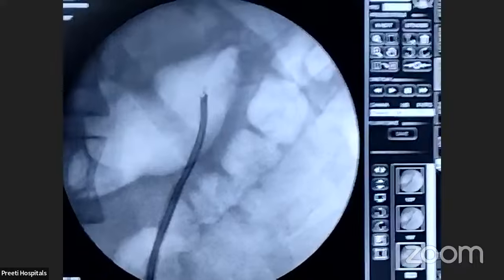So, completely over. Is it necessary to put a stent? Not necessary. Because it's post-stented, we can put the guide wire and come out. Now I will come with the guide wire along with the sheath. Give me the guide wire. Because it is post-stented, I don't have fear. So that one fragment also is not there. Why this guide wire? Only to keep the lumen open.